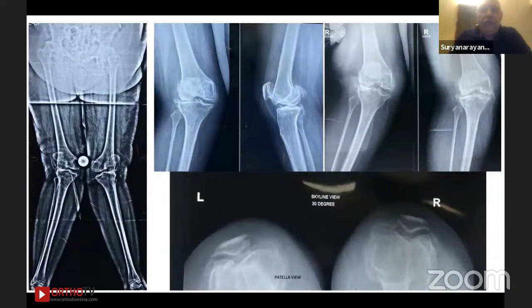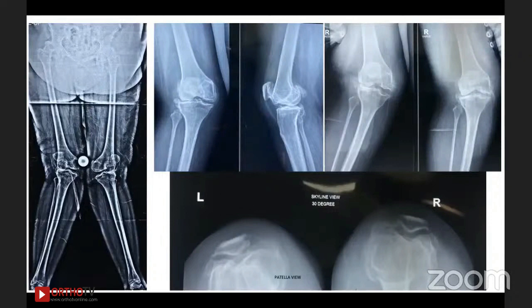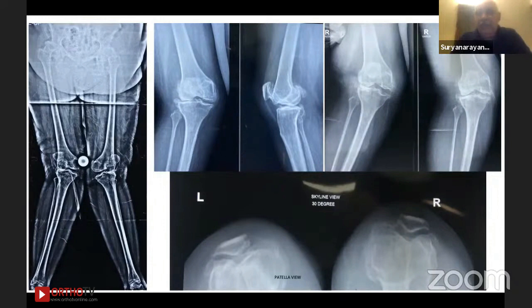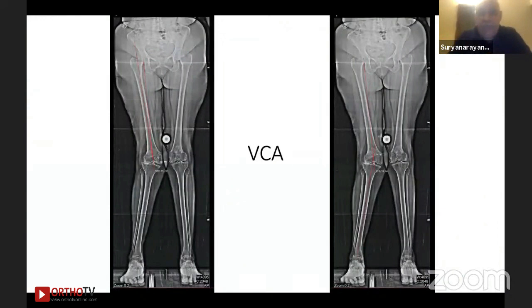This is the full set of X-rays you should always have — a policy for all knee cases in our unit. Short films alone are a total no-no, because you will miss proximal pathologies. In this case, she also has hip pathology on both sides. You must have a scanogram, valgus plane X-rays, valgus stress X-rays, and patellar views — so you know how the patella is positioned and what more needs to be done specifically for the patella.